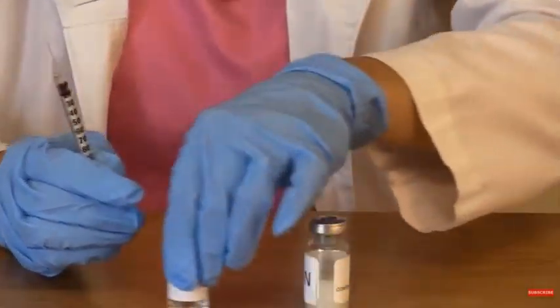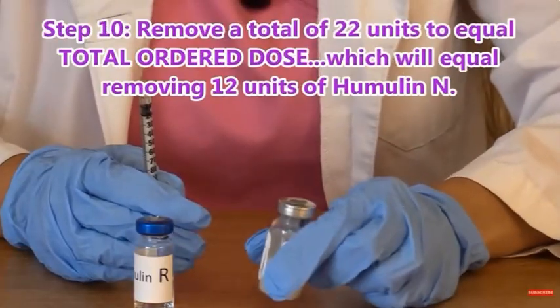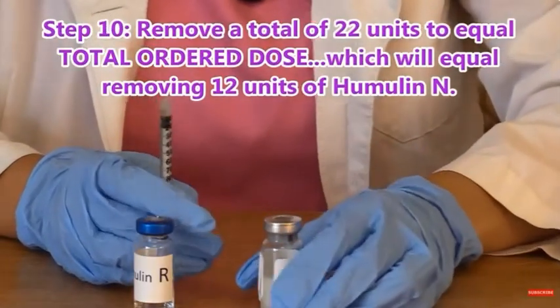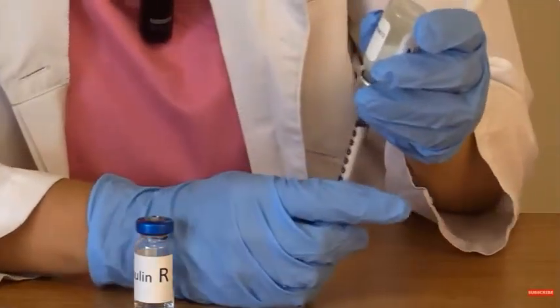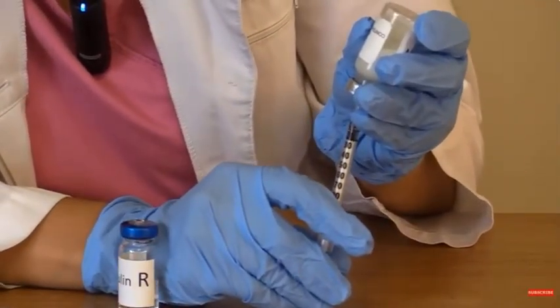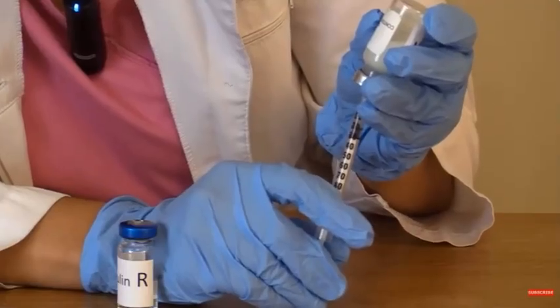Then we're going to go to our Humulin N, because that was the clear one first, and now we're going to cloudy. We're going to remove a total of 22 units for the whole total dose. So we're going to go into our NPH and remove a total of 22 units. And that will equal how much we're to give.